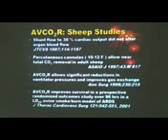Now there are a few studies. The initial studies were made on sheep, and they found that there is going to be an effective range in which the cannula size required is going to be low.